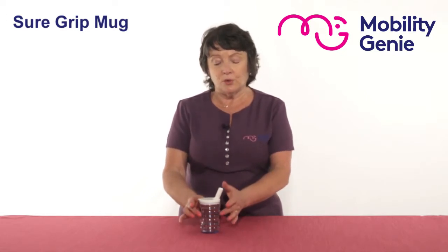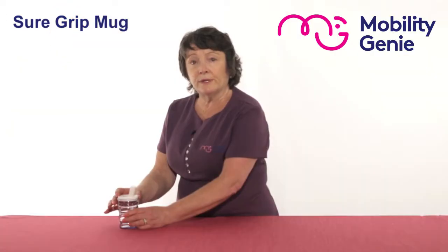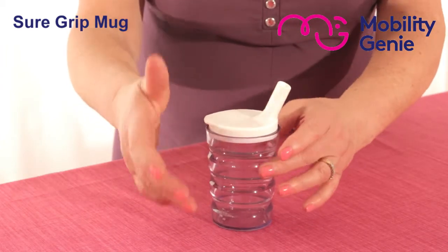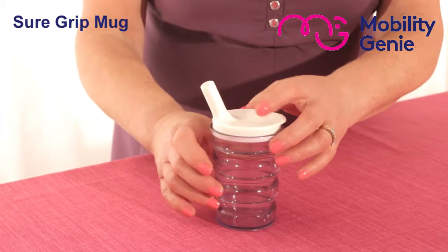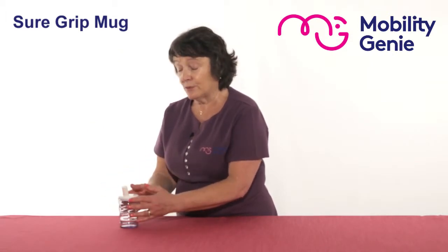So this here is a Suregrip mug. It's got an angled spout which allows for ease of use. It has grooves all along the cup, as you can see there, to allow for an easy grip. The unique lid allows for flow control and it helps to reduce spills.